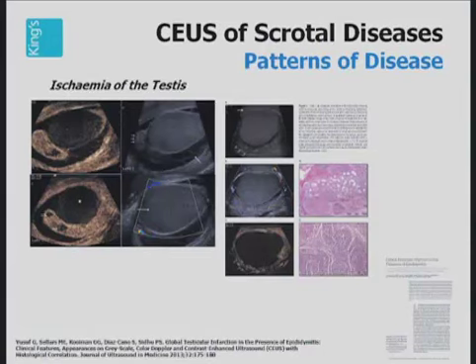The surgeons will remove this testes to alleviate pain, and you are able to give this information to the surgeons that there is absence of vascularity to allow this procedure to be performed with confidence. Increased enhancement in the epididymis is clearly demonstrated, and on this view you can see two small abscesses forming in the epididymis. There is absolutely no vascularization of the testes, there is no blood supply, and that testes will not survive. Orchidectomy is the correct management.